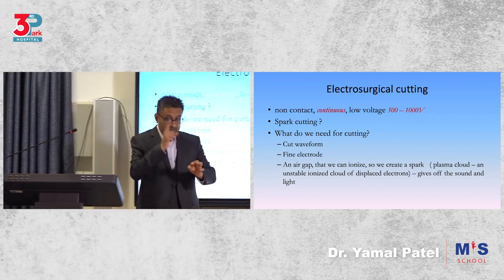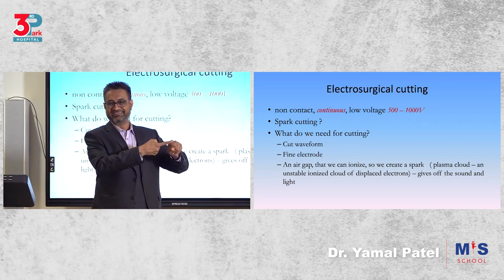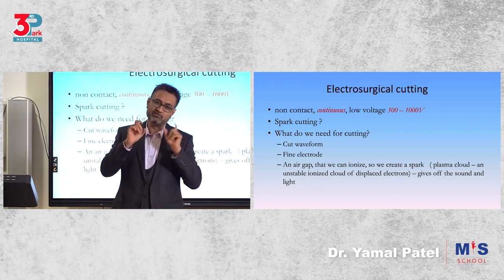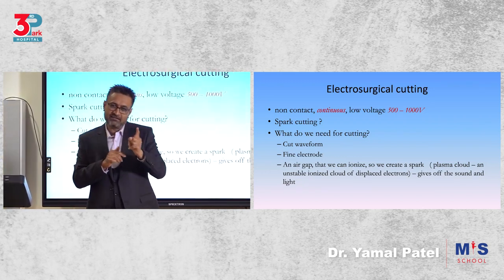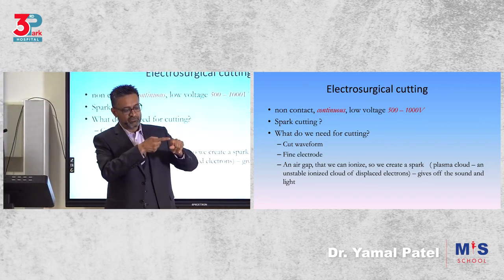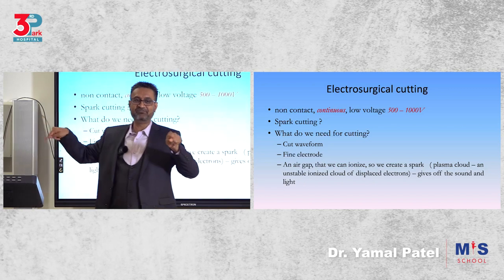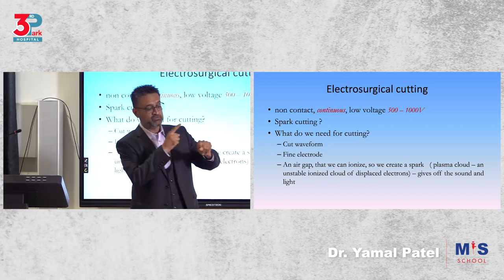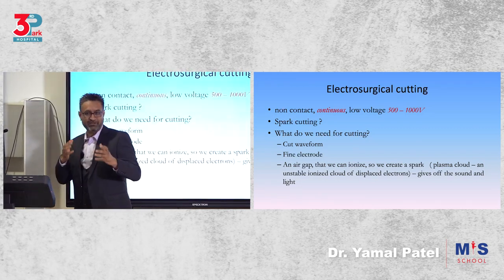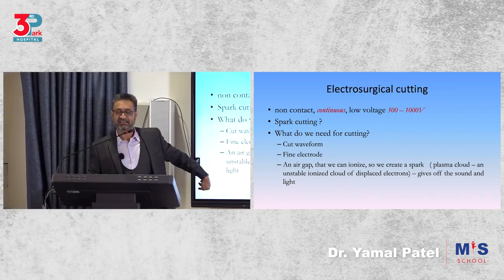So when you want to cut well in myomectomy, you don't touch the electrode and then activate, because then you're desiccating. Or let's not use the word cut, because we are mixing cut effect and cut mode. Let's say you want to vaporize. You leave a small gap, activate it, the yellow, touch, and now slice like a knife. You'll see it will cut very nicely. Whereas when you touch and activate, it will stick as you're going. You get the difference? So if you want to cut nicely, give a gap, activate, then slice. Okay?